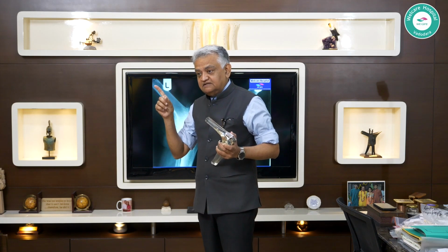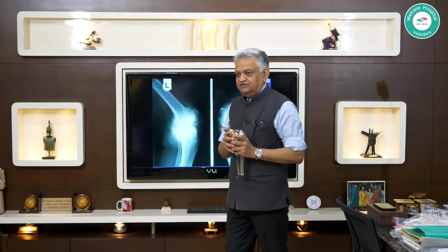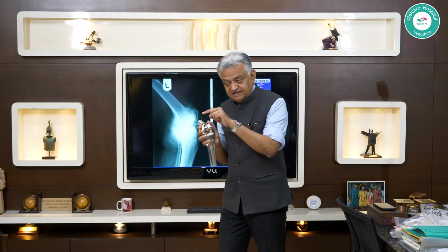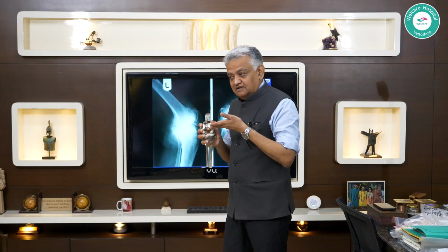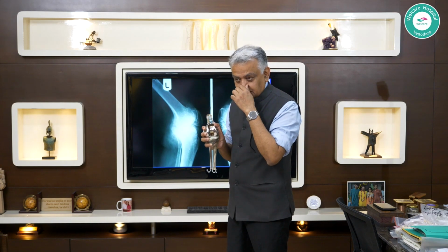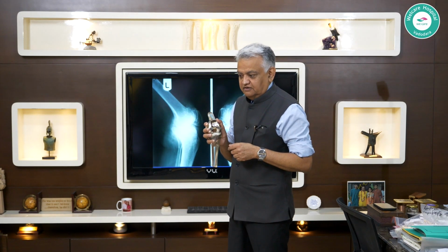In an image guided system, the CT scan has captured everything, and that entire volumetric data is fed into the navigation or the robotic brain, right? But in those imageless things, it is on table that you are telling the brain of the navigation what is the shape and the size of the bone you are discussing. So there is an algorithm.